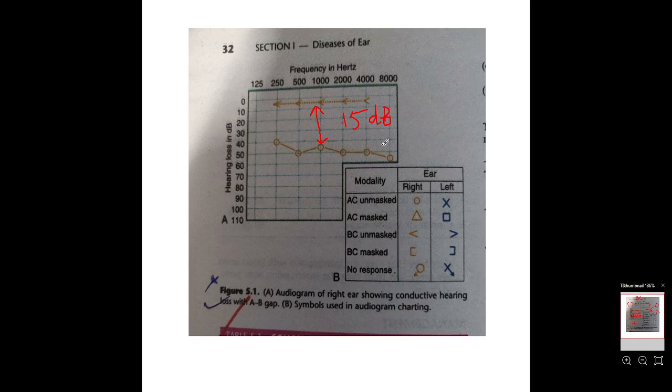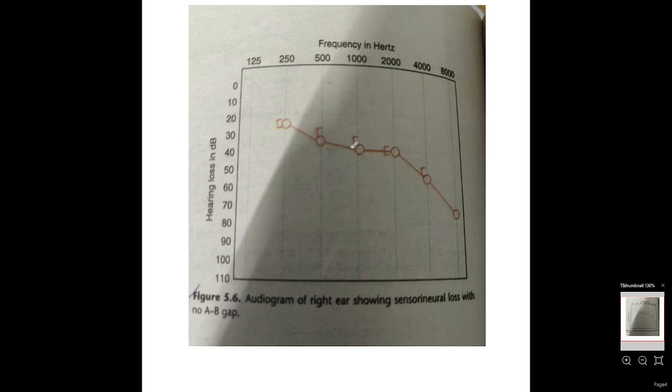Okay, if there is no distance between the two, so the distance is less than 15 decibel, it means there is sensory neural hearing loss, not conductive. If it was more than 15 decibel, then it was conductive hearing loss. But now in this case scenario, this is the sensory neural hearing loss, and the distance between the two is less than 15 decibels. Okay, let's move forward.